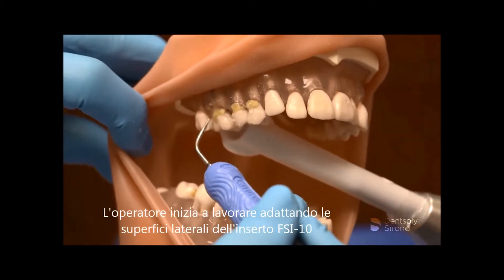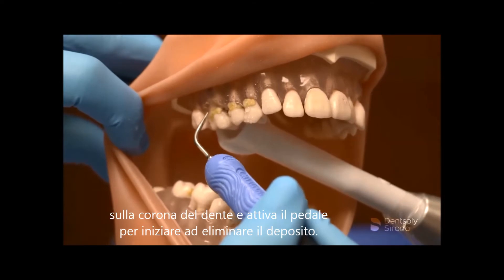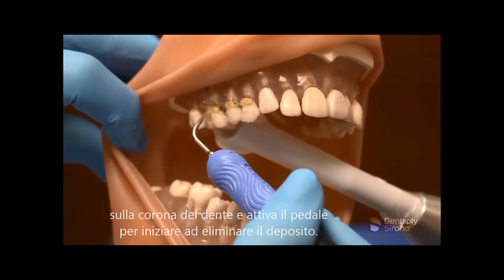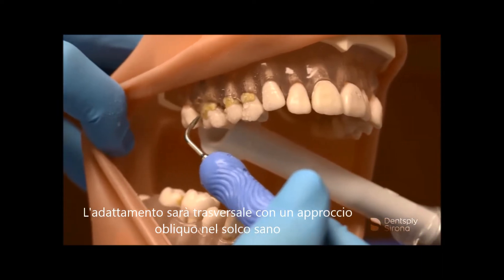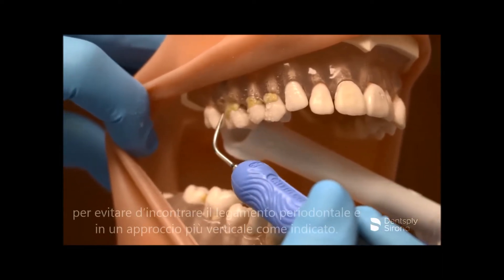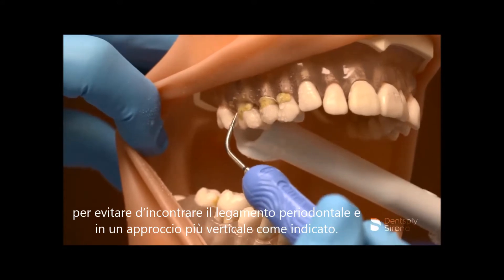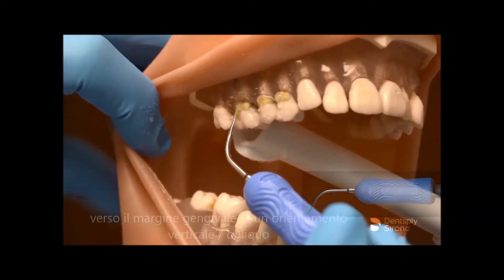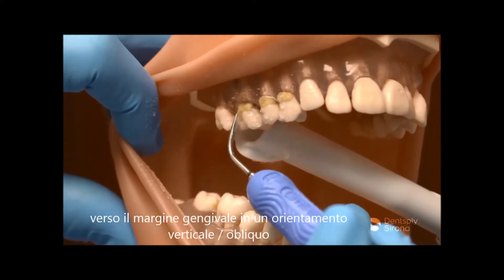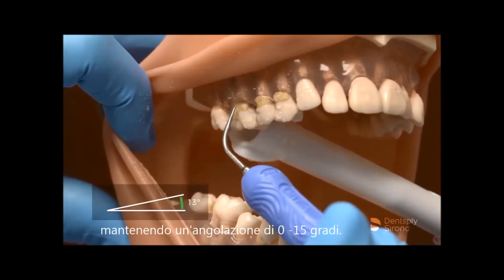The clinician begins by adapting the lateral surface of the Cavitron FSI 10 on the clinical crown and activates the foot pedal to begin the stroke. Adaptation will be in the transverse oblique approach in the healthier sulcus to prevent encountering the junctional epithelium, and in a more vertical approach as indicated. The clinician adapts 2-3 mm of the terminal end and rides the anatomy towards the gingival margin in a vertical oblique orientation while maintaining an angulation of 0-15 degrees.